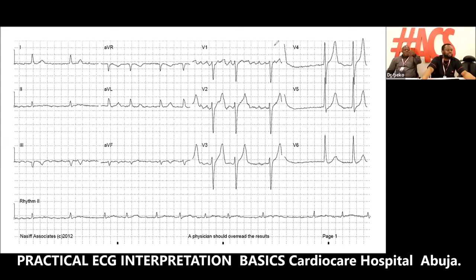So this one we have. Is lead I positive? Yes. AVF, is it positive or negative? Negative. What is that? Left axis. This is why it was right.